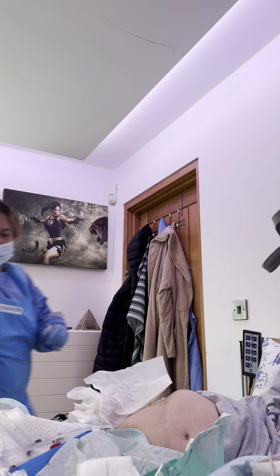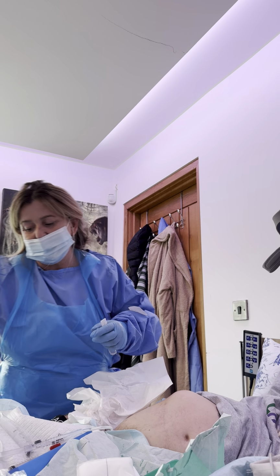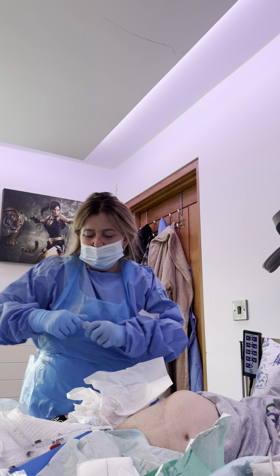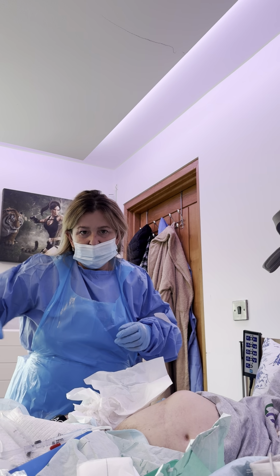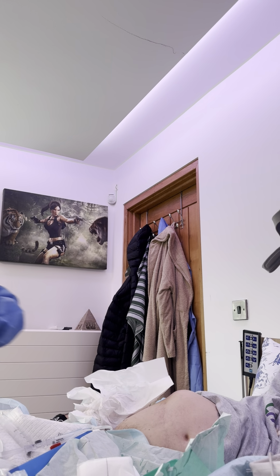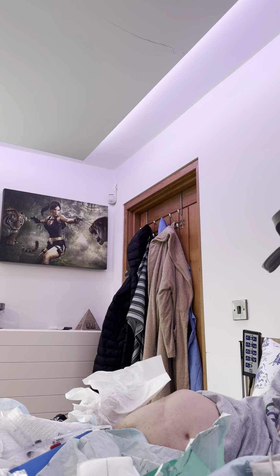So to be fair, I've got a new catheter pack this side to give this a clean. I will show you this first. I've done a bit now. I just wait for a new reading, but I'm going to show the actual catheter. So the site is beautiful, absolutely beautiful. No overgranulation, nothing.